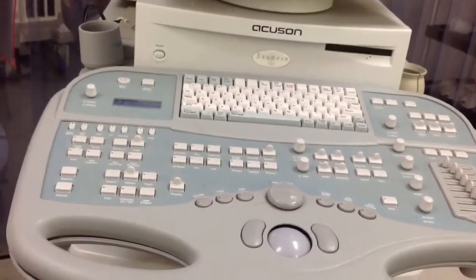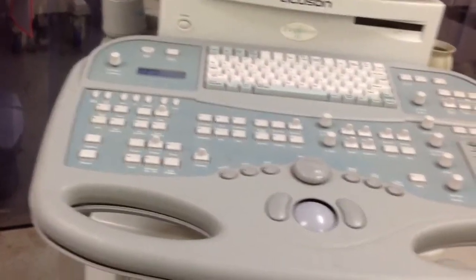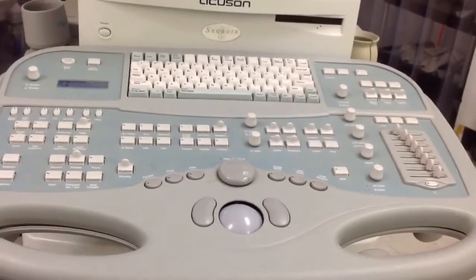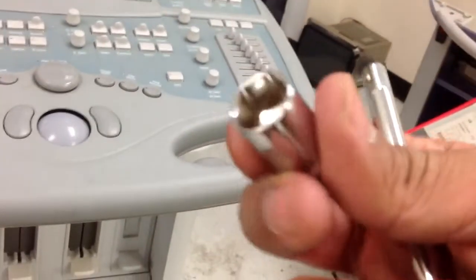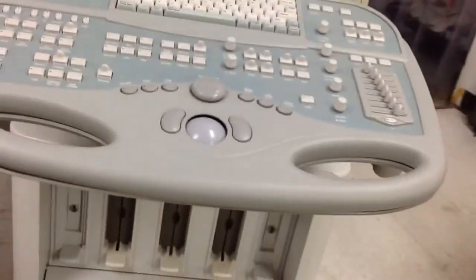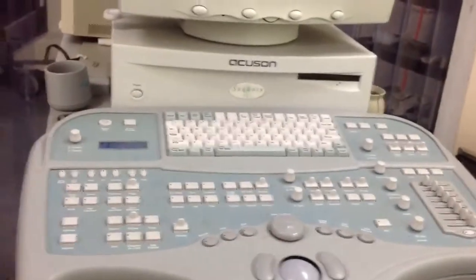I'm going to show you how to replace the freeze module for Sequoia 512 ultrasound machine. You need two types of tools. You need to have 13mm hex wrench, and you need to have screwdrivers for removing the screws from the bottom of the control panel of the Sequoia system.